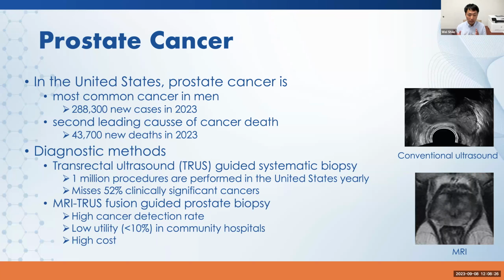biopsies, what we call systematic biopsies. How it works is that the clinician takes several biopsy cores from your prostate. Systematically means you divide your prostate into 12 different regions, and you take one biopsy at one region with the guidance of this real-time transrectal ultrasound image.